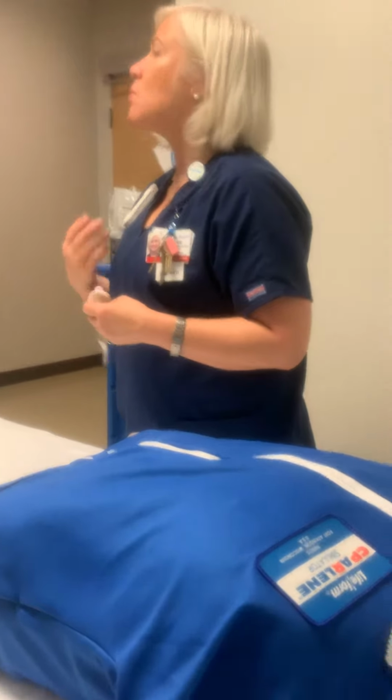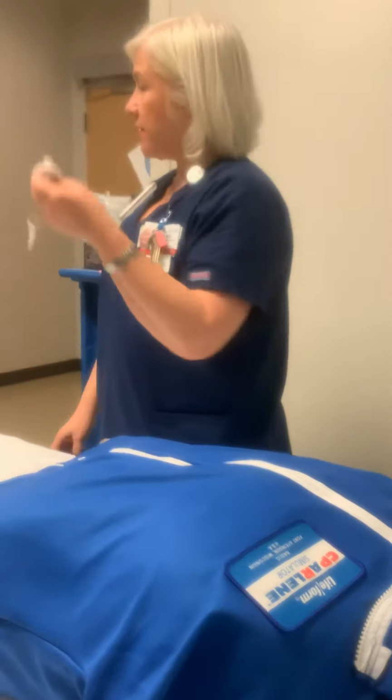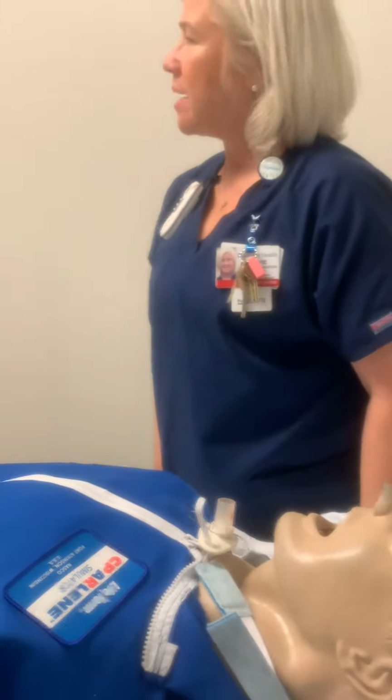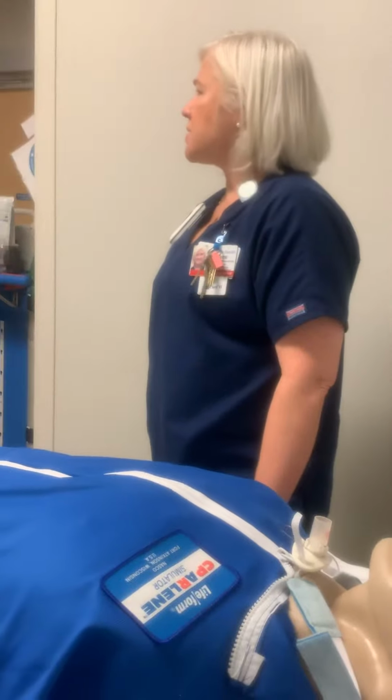In that event, first of all, if you call me, I would come over, and the first thing I'll ask is, do they have an obturator? Well, we don't see one. I'll ask what size trach they have, and I'll grab one and pop over. Then I'll give it to the patient and tell them they have to keep it with them at all times, because you have to have an obturator to put that thing back in. So what sizes are there? You have 6, 7, 7.5, and 8 trachs, so you have different sizes.